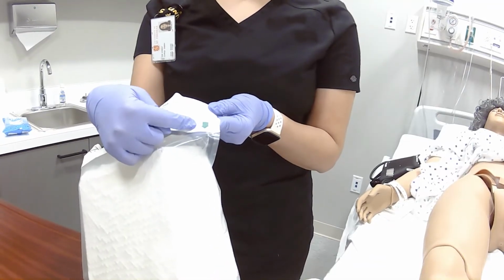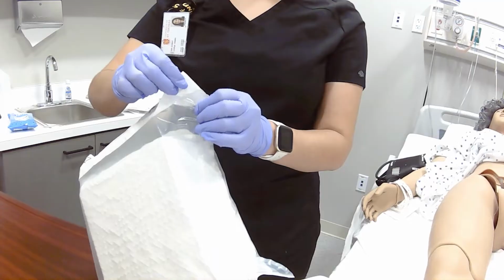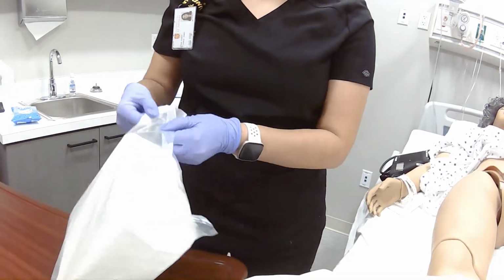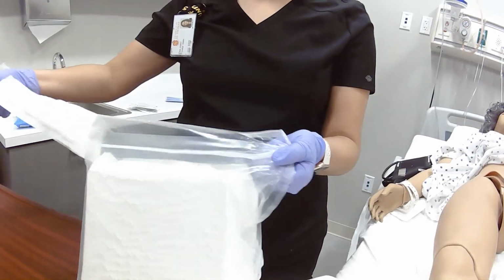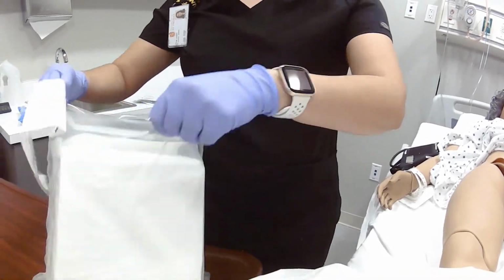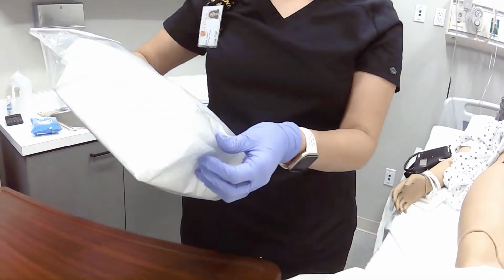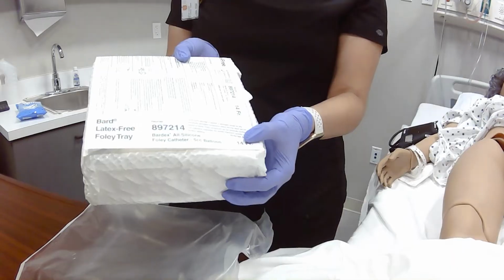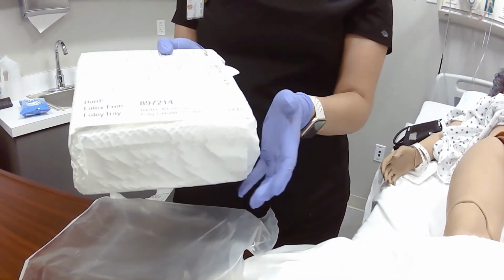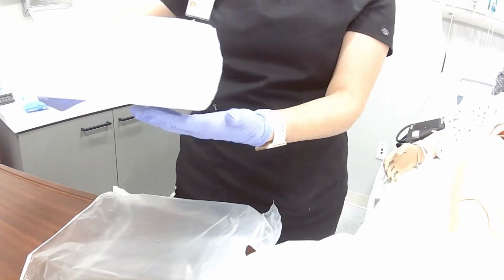So you're going to see a little arrow on the edge. So you just pull on that, and it will open across, like so. Okay? I'm going to keep this packaging because I'm going to use it as a trash receptacle. When you remove your catheter kit from the packaging, you're going to see the shininess on the drape.